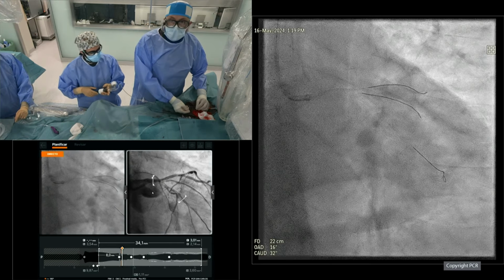But there's something very important. Stent boost here, and they will put it too. Wait a second, we have to put it on X-ray. Live, yeah. Okay. So we're making now a stent boost. It's not too bad, Nieves. I'm going to make a test with... I think a bit more proximal, to be honest, but it's not too bad for a POT.